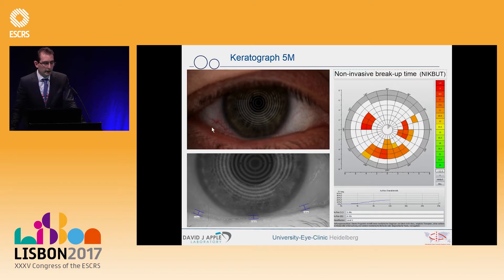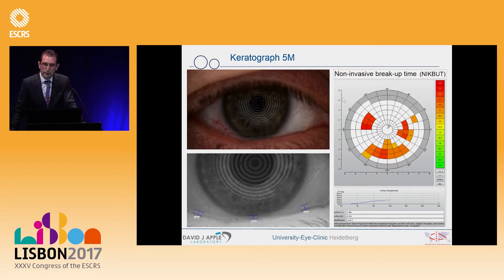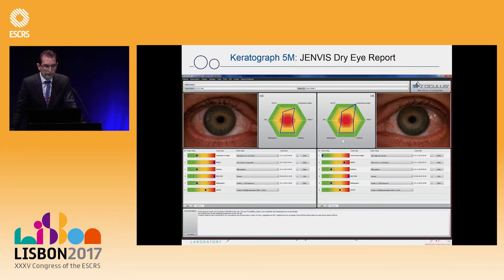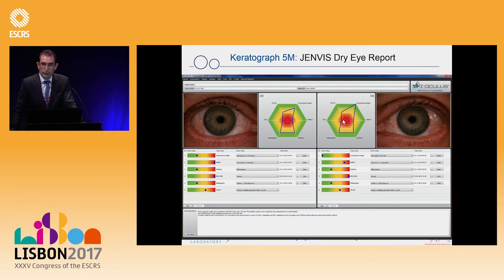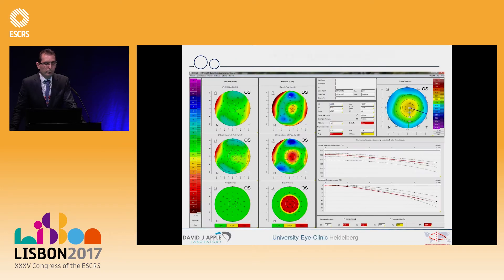When looking at a nearly regular eye, you can see a small redness and the tear film amount appears quite normal. But when you examine tear film quality — an indicator of non-invasive breakup time — you will see it is closely affected even after four seconds, which may impact visual quality. This is what the Keratograph 5M software outputs in the Jenvis dry eye report. The blue points in the red region are outliers in this six-fold diagram, where preoperative and postoperative measurements are compared for both eyes — closer to the center means more suspect for tear film problems.